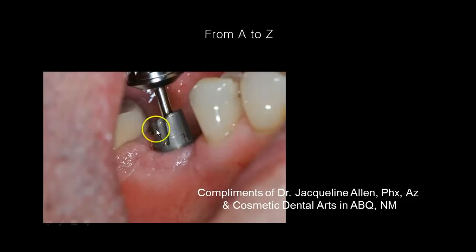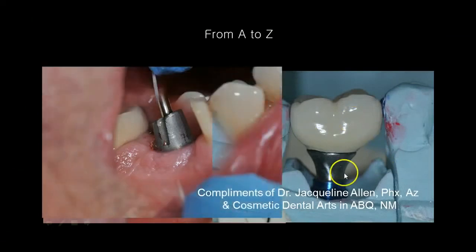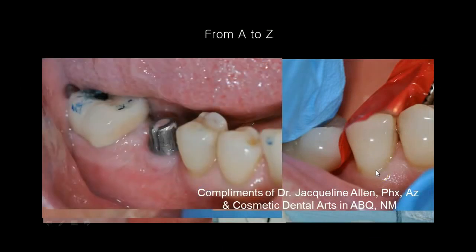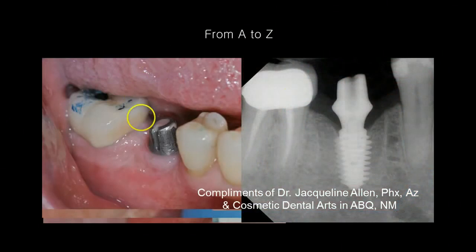So here's a UCLA abutment. You can tell here's your custom cast abutment. It has a facial groove on the line on the abutment for orientation. Okay, and here you can see the restoration on the crown. So we remove that after checking the contacts, doing your occlusion check and contacts and everything else. Everything was great. We went ahead and torqued the abutment in place. We sealed it off with, I believe, polyvinyl siloxane that expanded in the area, and then we removed that little excess there.